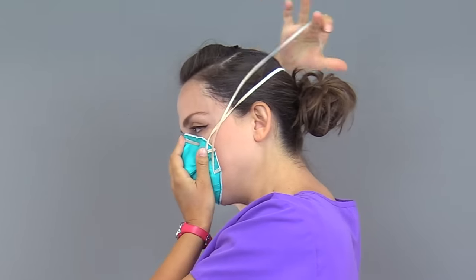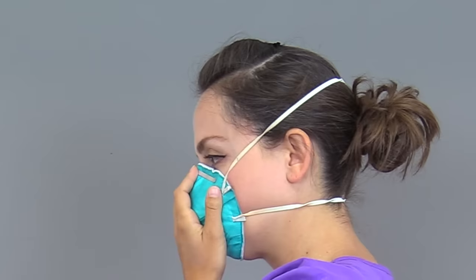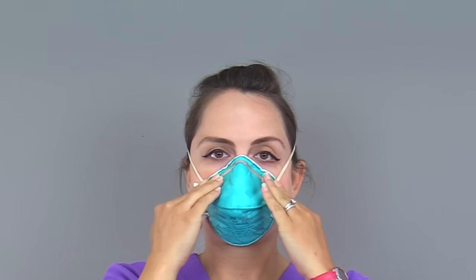Then take the bottom strap of the respirator and place it around the bottom of the head, just below the ears. Make sure the straps are not crossing or are overly twisted. To ensure a proper seal of the respirator around the nose area, use the fingertips of both hands to bend the metal nose piece around the nose, starting in the center and working your way outward on each side.